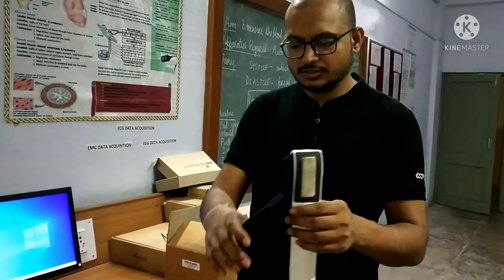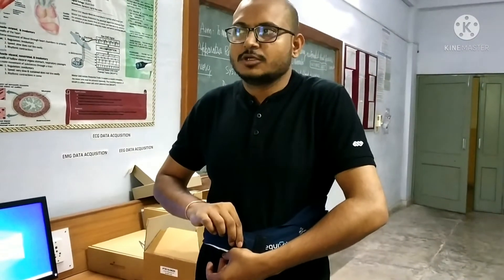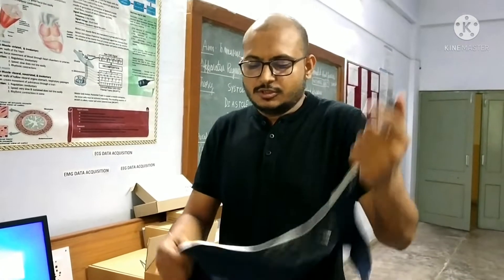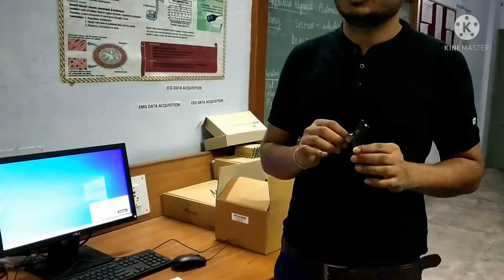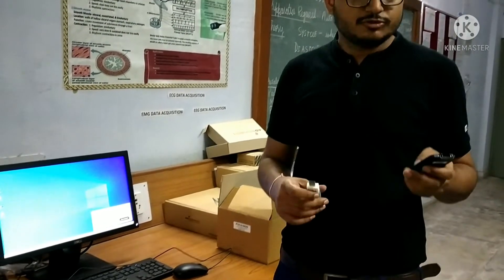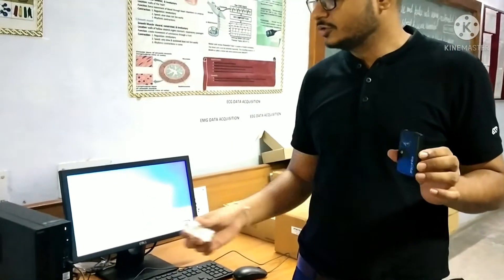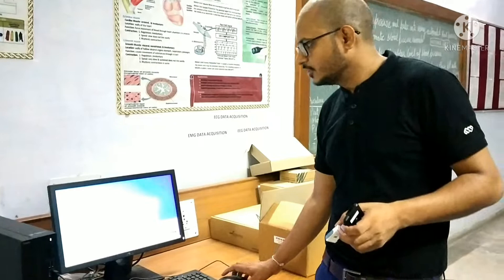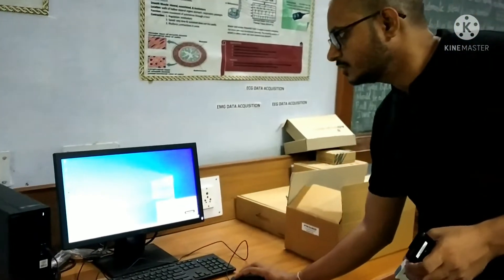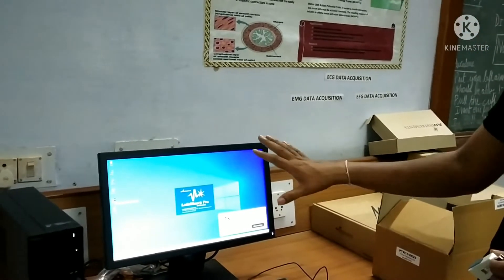After wearing this belt directly against the bare body, after doing any exercise or activity, the signal is obtained by this Sensor Electronic Module. This Sensor Electronic Module also wirelessly transmits the signal via Bluetooth to this system, which consists of LabChart software. LabChart recognizes the signal and displays it on the screen.